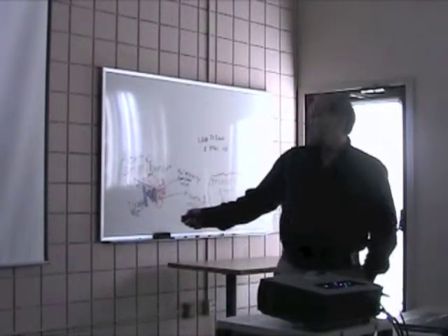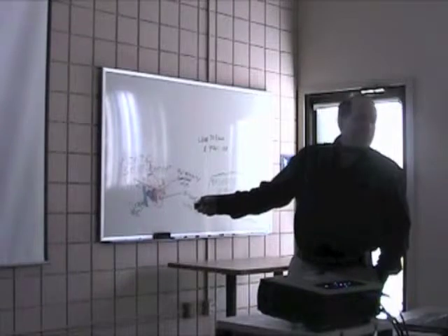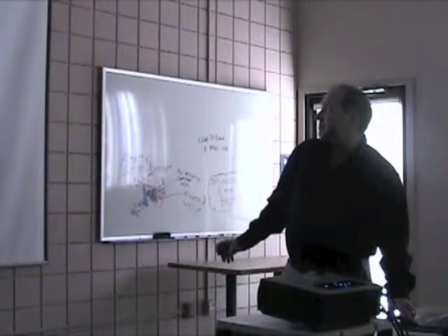Same thing. This is the aortic root of the pig. This is the cloth that they sew on there. And this is where the coronary arteries to the pig used to go. And then the person's coronary arteries will line up there and feed in, in the human that it goes in.